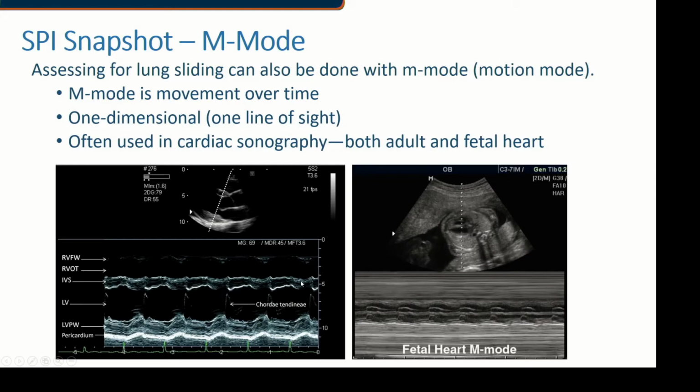And so if we start at the top of our screen, we are encountering on this particular image the leading edge of the right ventricle. And as you know, the ventricle itself is anechoic, and so that's mirrored on the motion graph as well. The leading edge will have your brightness, but the chamber itself will be black.